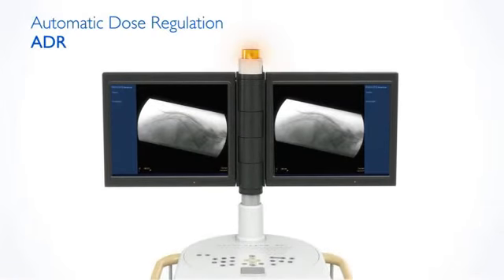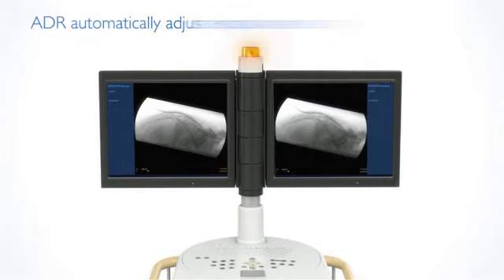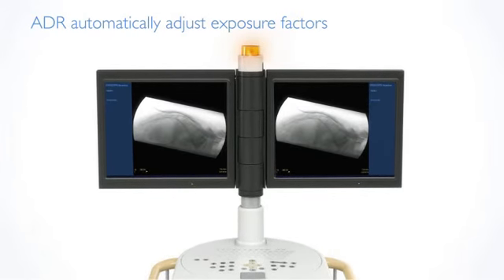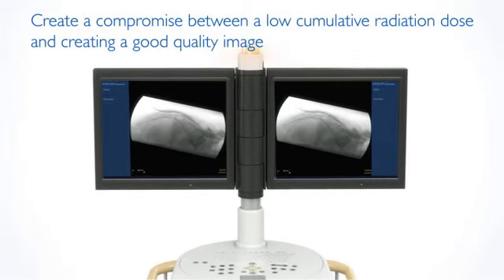Most C-arm systems have a measuring field for automatic dose regulation, or ADR. The purpose of ADR is to automatically adjust exposure factors to create a compromise between a low cumulative radiation dose and creating a good quality image.